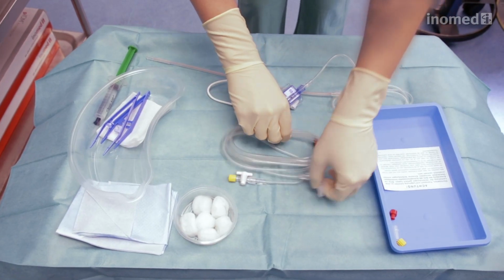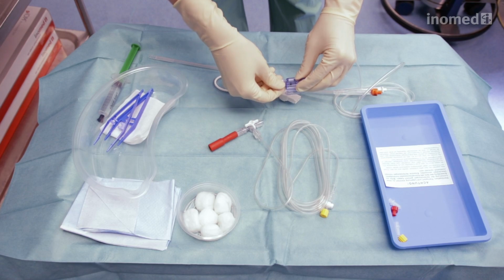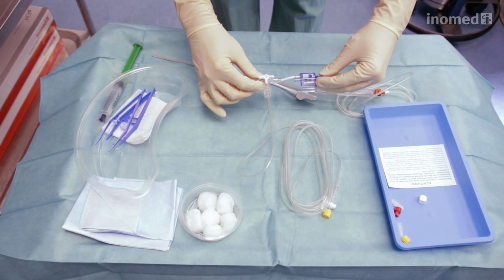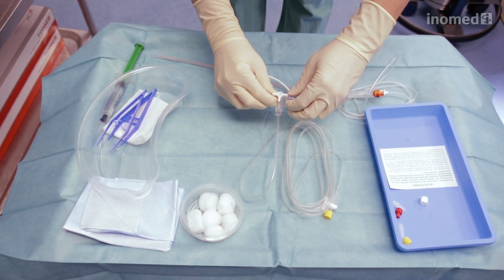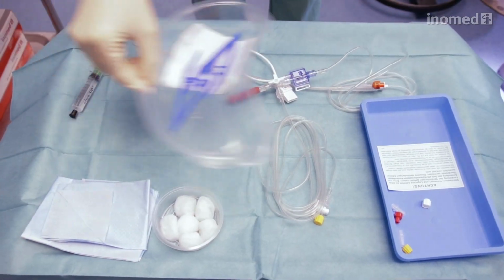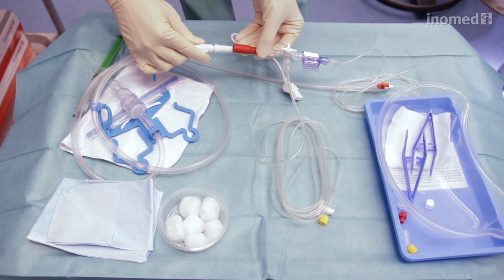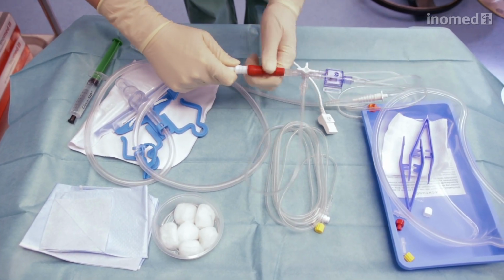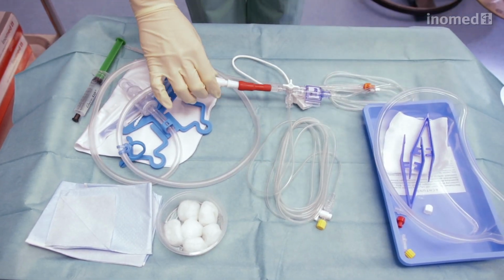The white cap side of the sensor is connected to the free inlet of the three-way valve. The valve should link the catheter and the urine bag, which means it has to be turned by 180 degrees. Finally, the urine bag is attached to the funnel on the three-way valve. Now, the catheter set is ready to be placed on the patient.